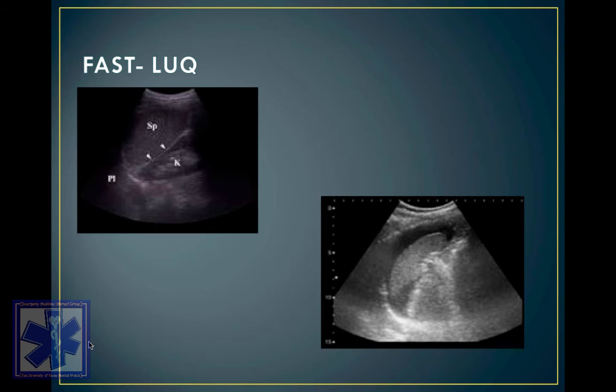And what you'll see is the fluid creep down just like before around here, or alternatively it'll layer back here between the diaphragm and the spleen. And you can see spleen right there, kidney down there, fluid layering out.